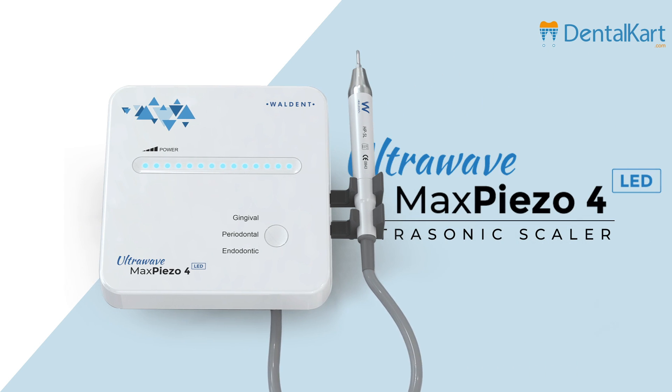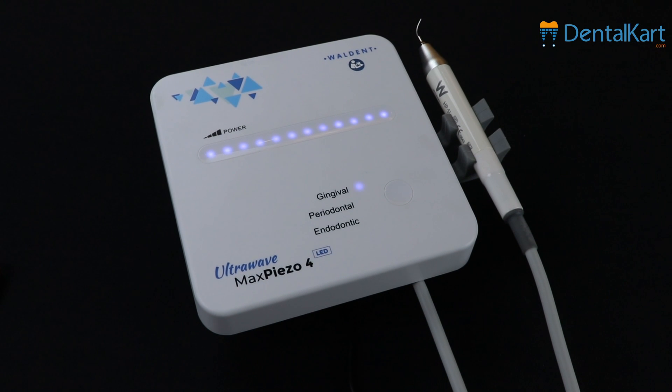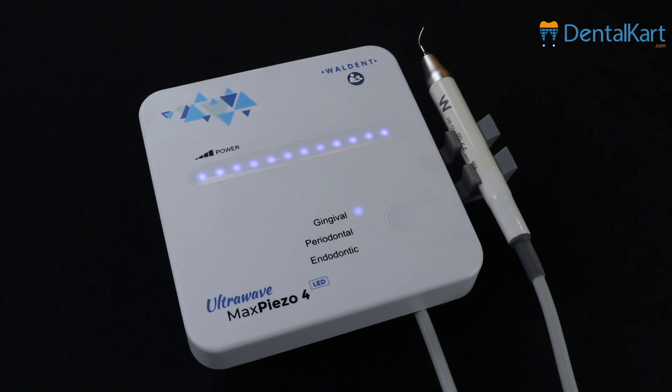Hello, everyone. Today, let's explore an exciting new tool in dental care: the UltraWave Max Piezo 4 LED Ultrasonic Scaler.